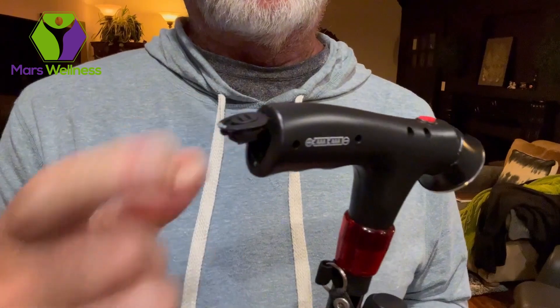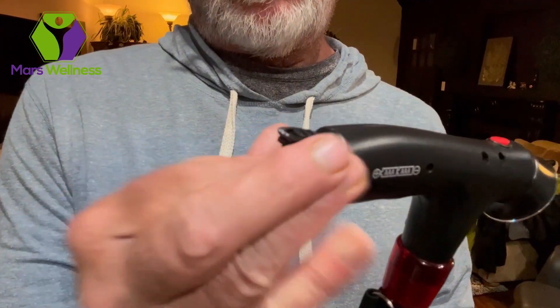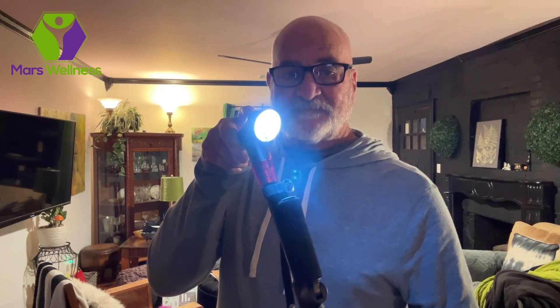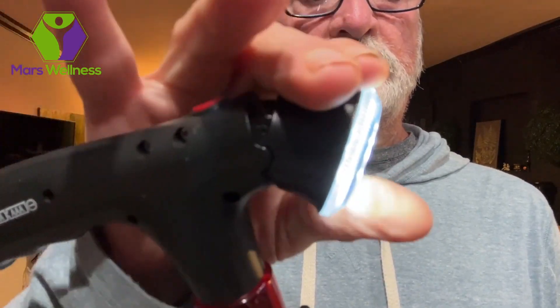Need light? Open the battery compartment and insert the batteries with no problem. Batteries not included. With a powerful LED flashlight, you can see and be seen day or night. Adjust the light angle to suit your needs — just snap it into place.